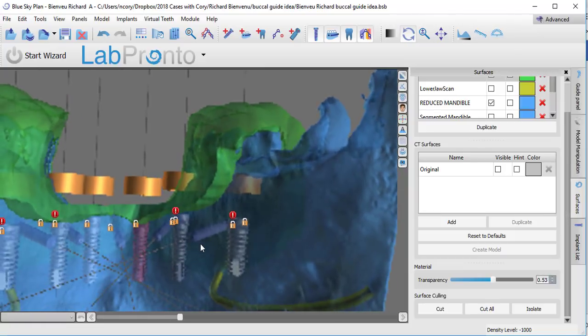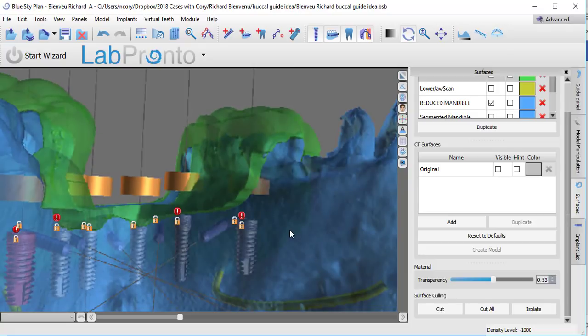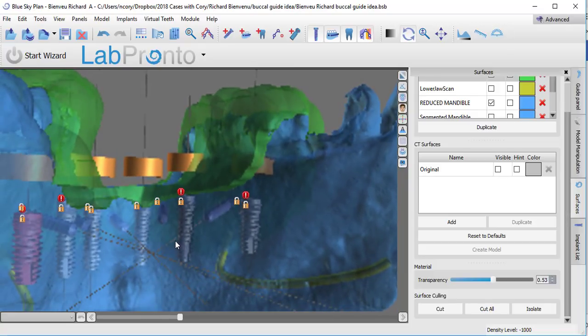Now I'm going to come back and I'm going to orient where I can see these tubes on the lateral side. Now, I don't want my cuts to be in different planes. I do want to keep everything smooth and flowing and not be changing planes. So I'll look at it from this direction, but I want to orient it where I'm flat with that previous cut. And now I'll come back and I'll make the cut for this side.